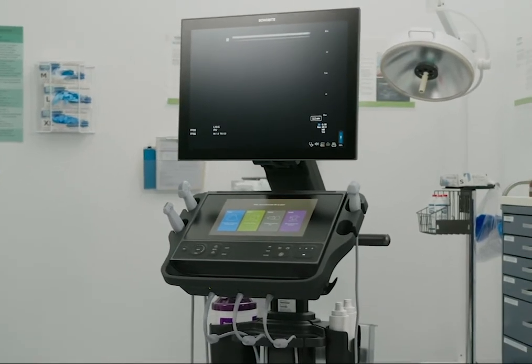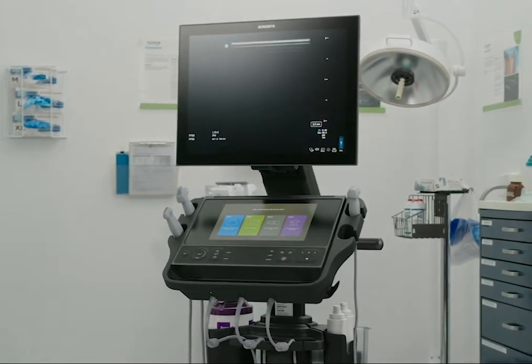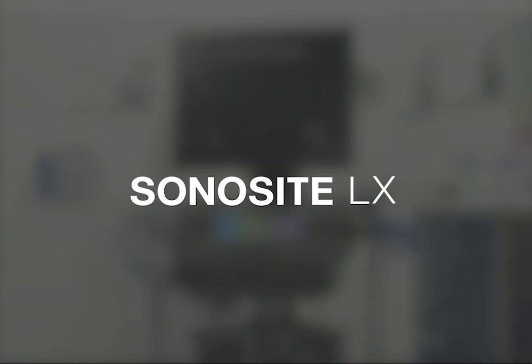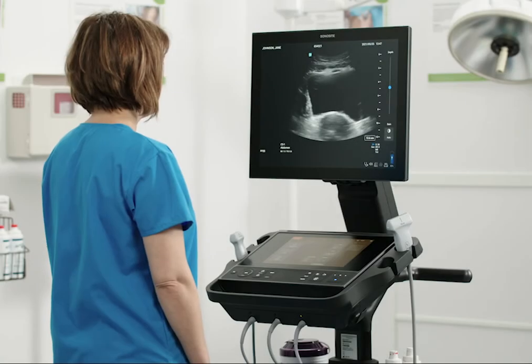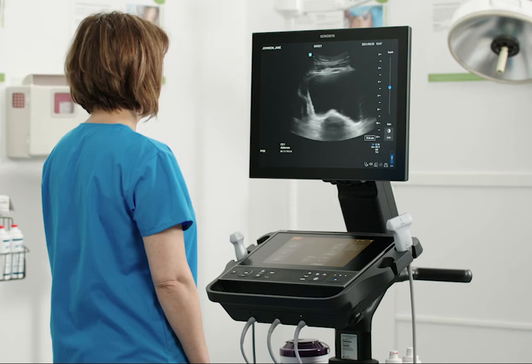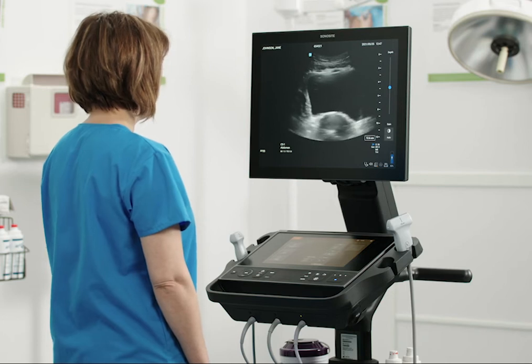Welcome to the help video, Taking Measurements. In this video, we will walk you through how to take measurements with your ultrasound system. On the system, most measurements are performed with calipers.